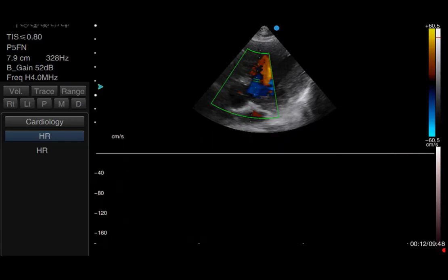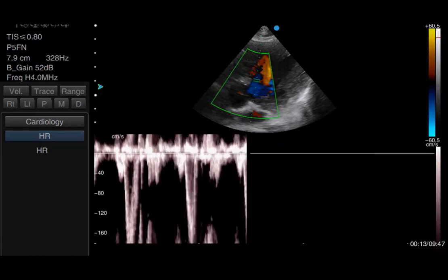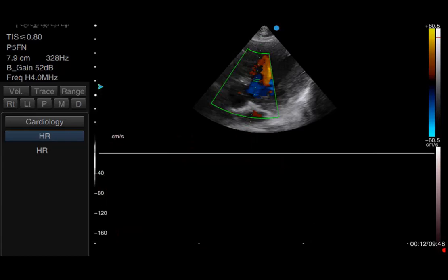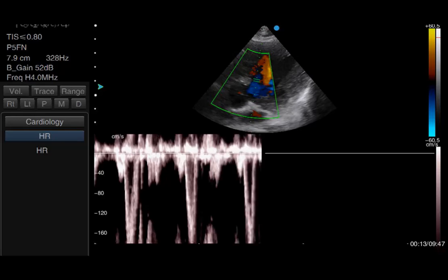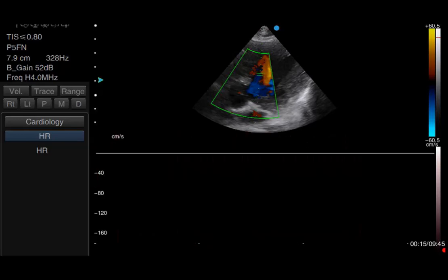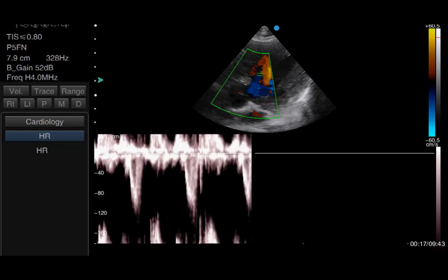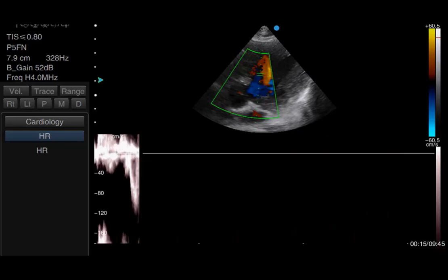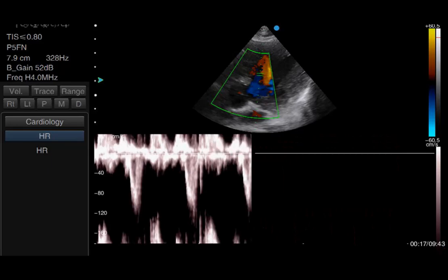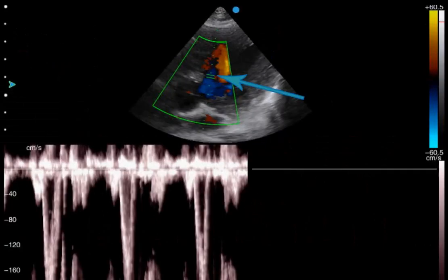Retracting the sample gate slightly results in a slightly less turbulent flow, but still at a velocity far too high for my pulse wave Doppler to sample. Retracting it further still back into the left ventricle finally gives a lower velocity trace — the type of velocities we're used to seeing in the left ventricular outflow tract. This technique allows us to pinpoint exactly where the obstruction is.